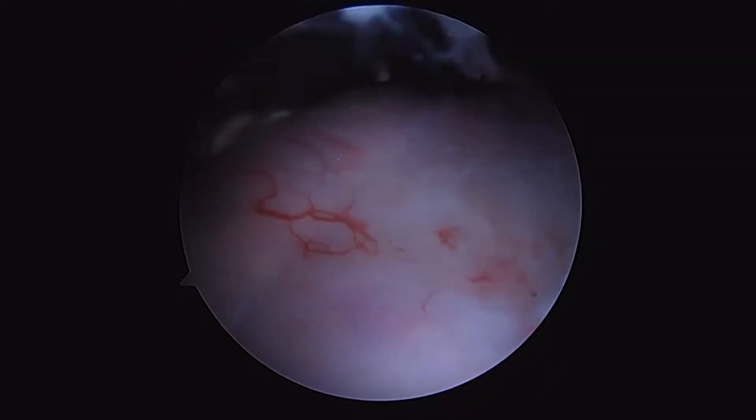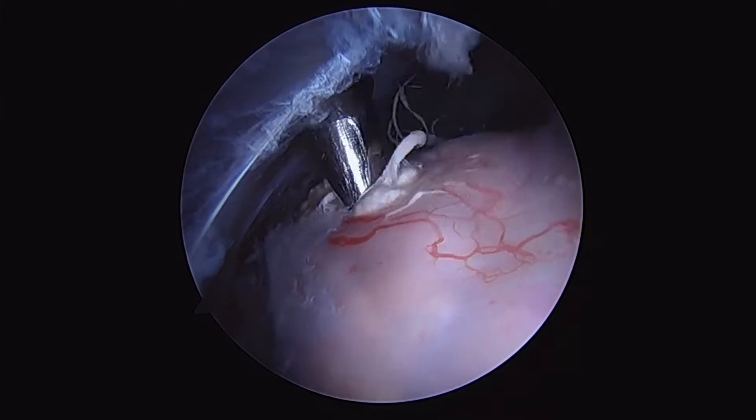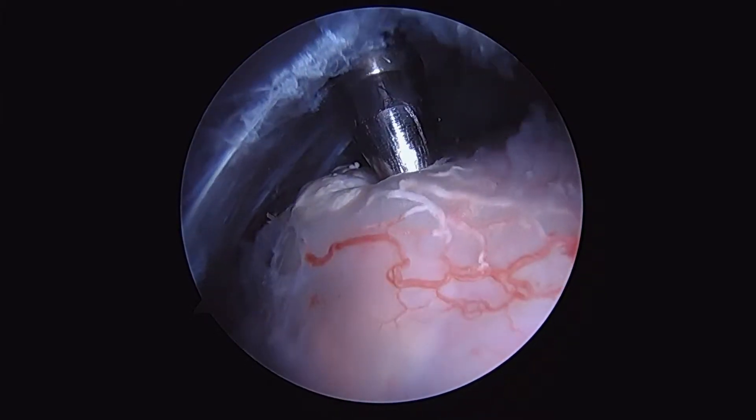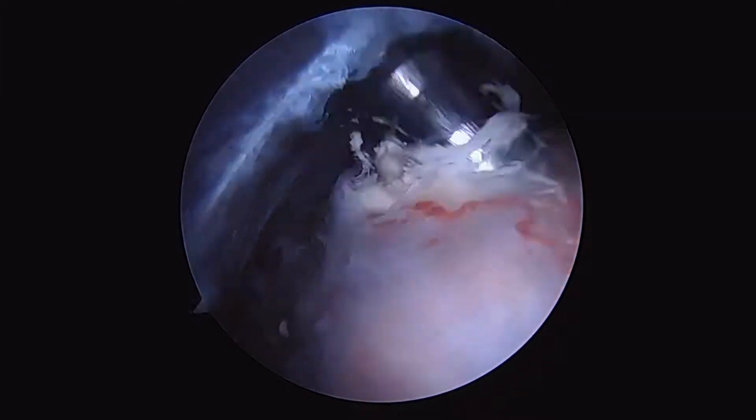In this patient, we're going to use the Rotation Medical bioinductive implant to graft two very large areas of tissue deficiency in this patient with calcific tendonitis involving both the supraspinatus and infraspinatus tendons.